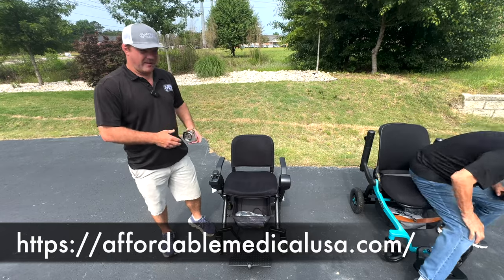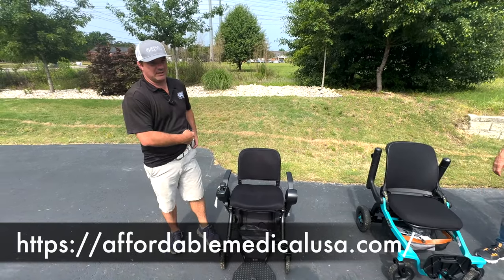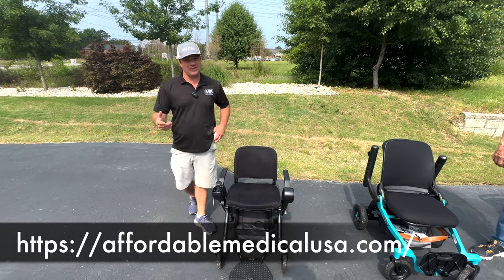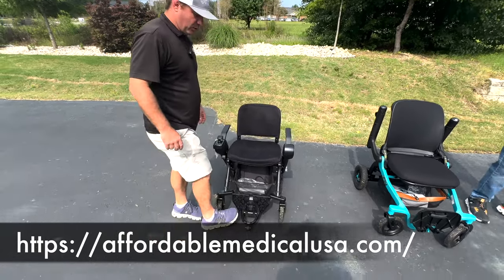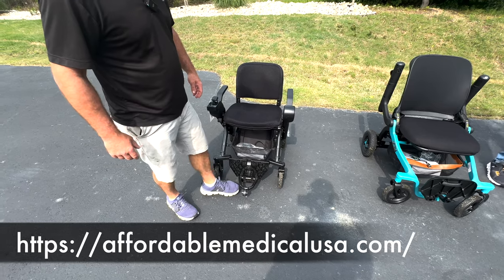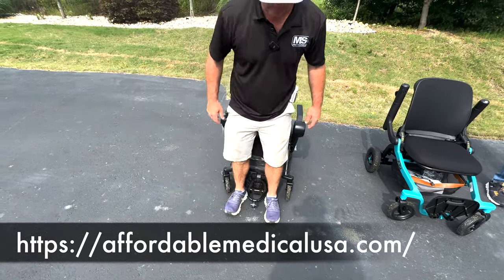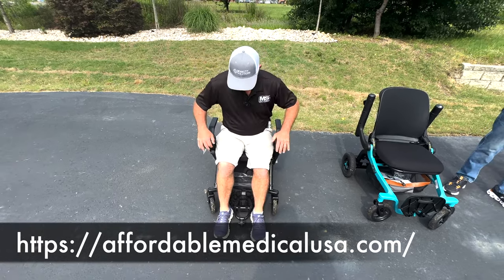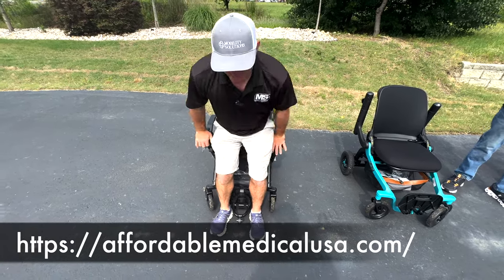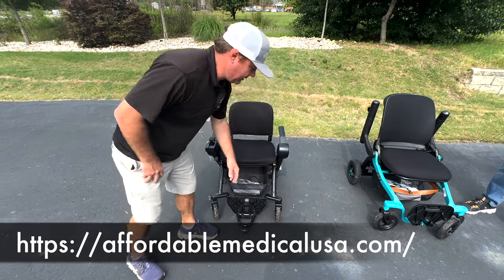So if you currently have a power wheelchair and you can't get through your bathroom doors or you have some narrow doorways, I've had people buy this just because of that reason. This foot plate's pretty easy to pull up and down. I don't really care for this bar too much, but I just got off the phone with someone that has this and he's interested in another chair and they have no issue with it at all. So you can put your hands here to get up. I like that. You have a little storage bag underneath it.